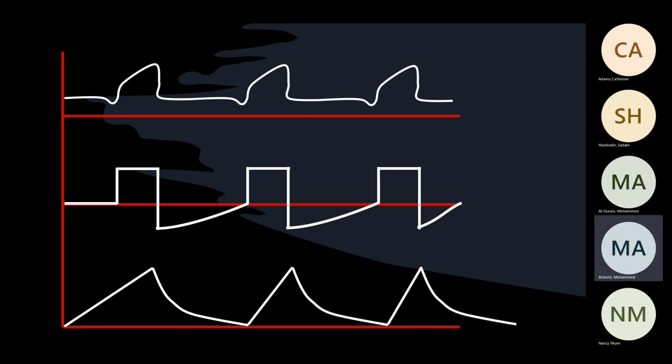So you are seeing all of these are triggered by the patient. Is that right? And they all have the same shape and the same cycle and everything. So here, there's nothing that has been done by the patient himself. So it's not intermittent. It's all mandatory breaths. Yes, the shape of the volume, maybe when I was drawing, is not exactly the same, but if you look at the line itself, the volume itself is the same.